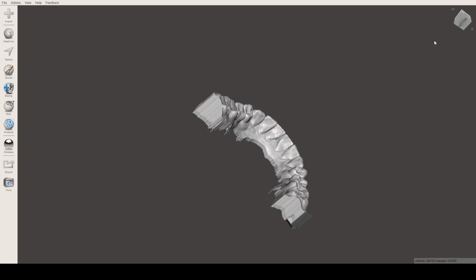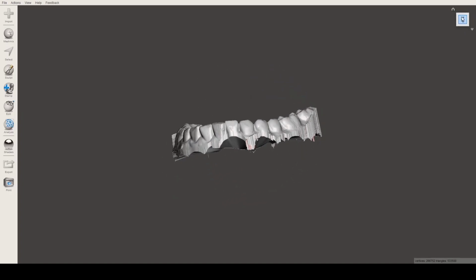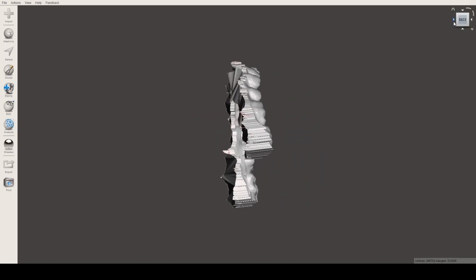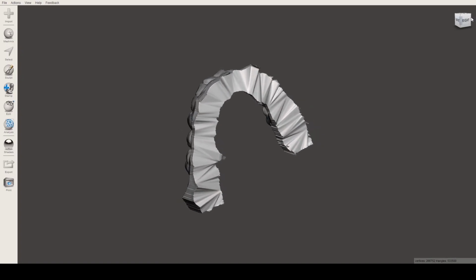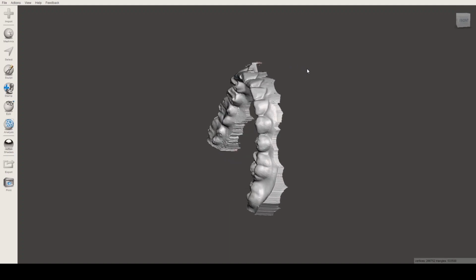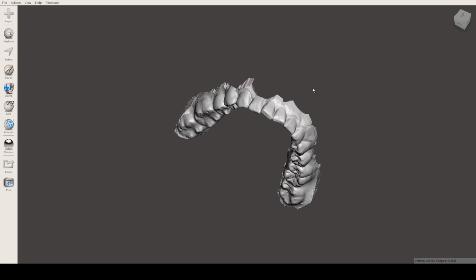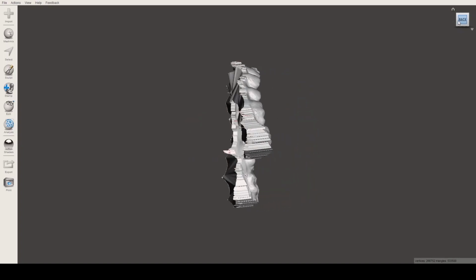What we're going to do now is make our model right, because the positions of our model are kind of not what we want. If you can see here, this is the front, but what we want to be the front of the model is not this one right here. Where's the front?